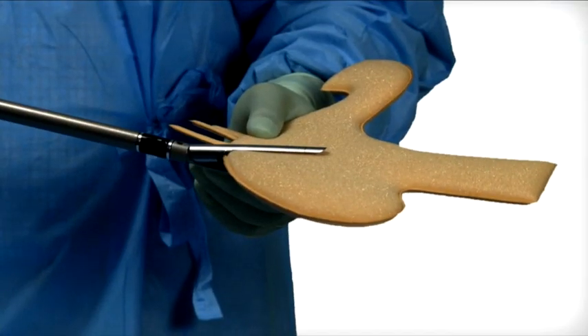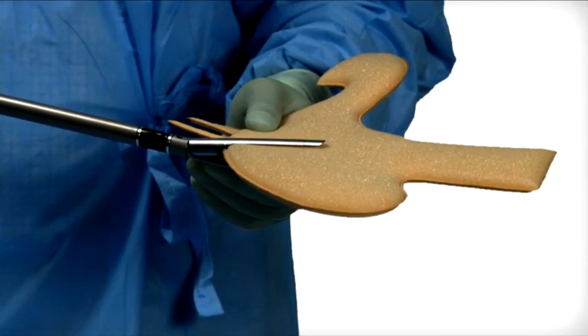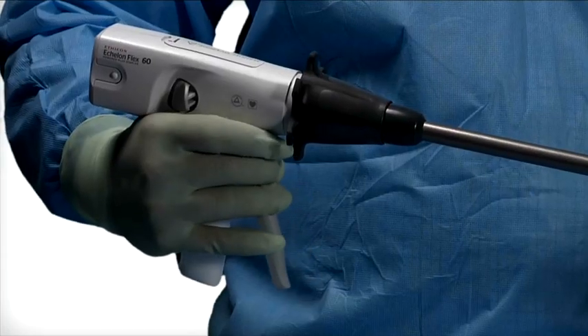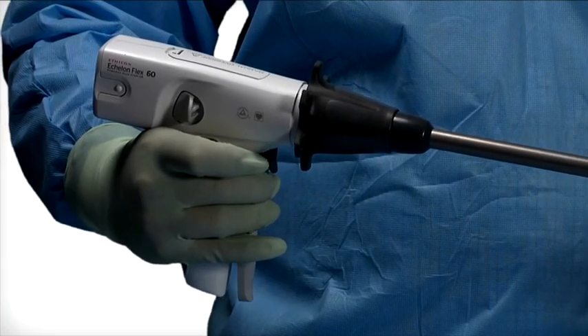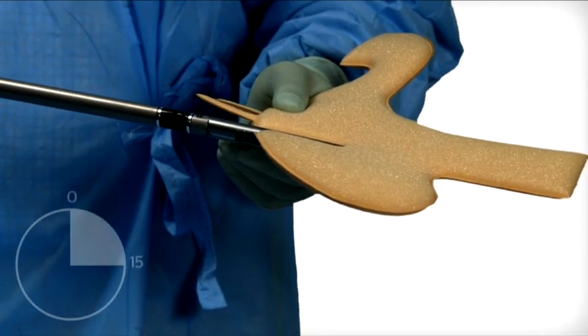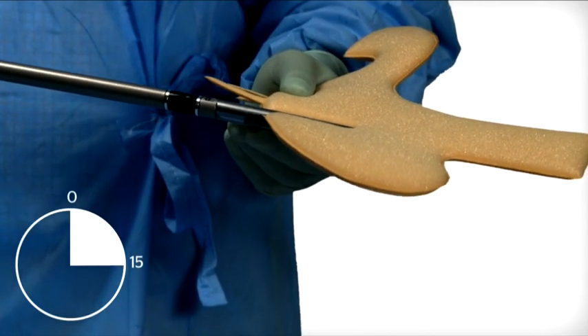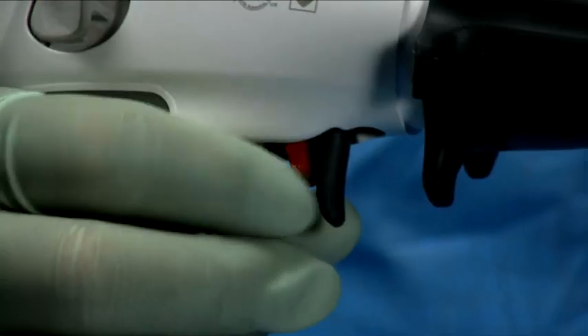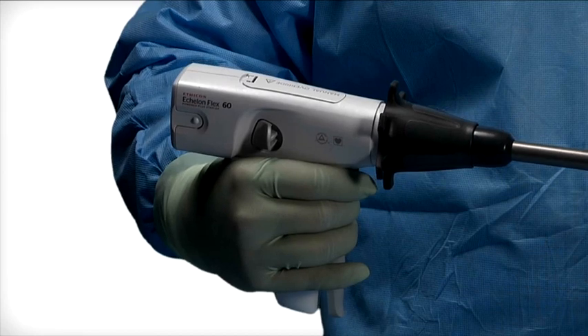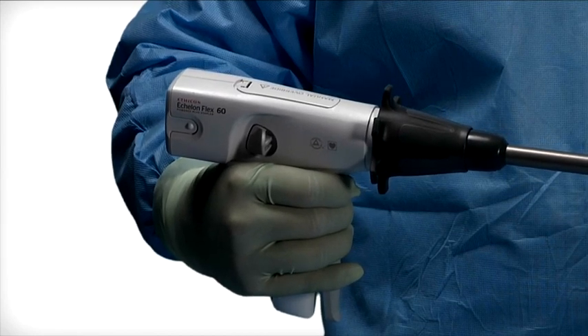Firing the device. While ensuring tissue lies flat and is positioned properly between the jaws with no obstructions, fully close the closing trigger until an audible click is heard. For better compression, hold the jaws in place for 15 seconds after closing and prior to firing. Pull back the red firing trigger to unlock, then pull the exposed trigger to fire. The motor action will be heard.